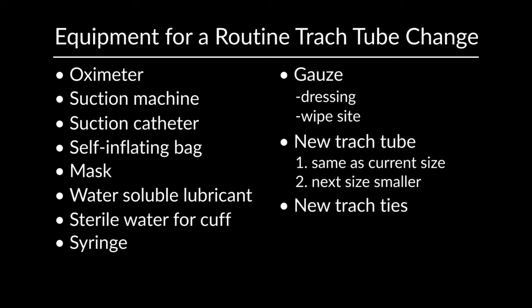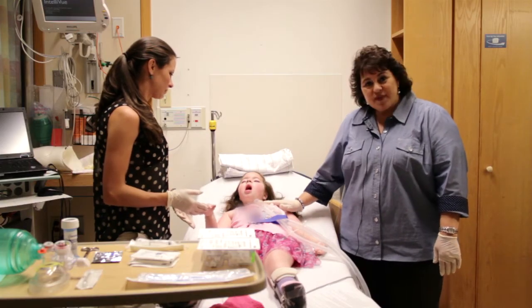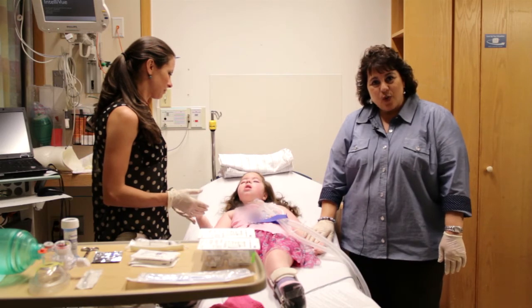and that will be placed on after the tube is put in. We discussed earlier that there are different preferences by different folks. Some choose to put the tracheostomy tube tie on the trach tube before insertion. Some choose to put the gauze on before insertion. Others do it after. It's important to evaluate the child for the need for suctioning prior to the tracheostomy tube change. Drew is very clear of secretions right now, so she doesn't require that.